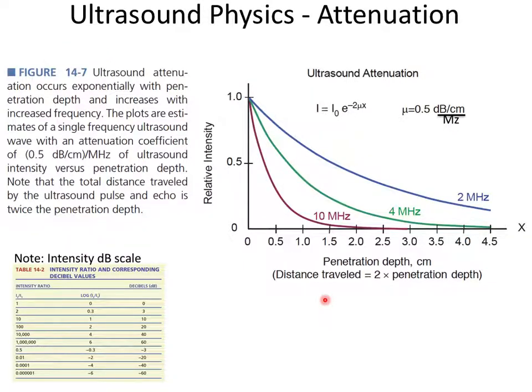So just like X-rays get attenuated in a medium, ultrasound also loses amplitude as a function of distance in the medium. It's easy to understand that if you're vibrating something at 10 megahertz, and that wave is going through, you're losing energy because you're vibrating the substance and heating it up, right?